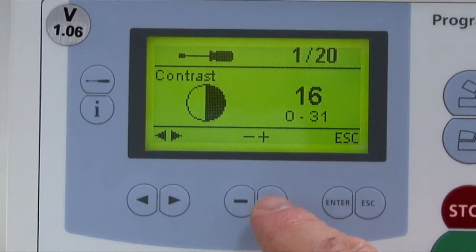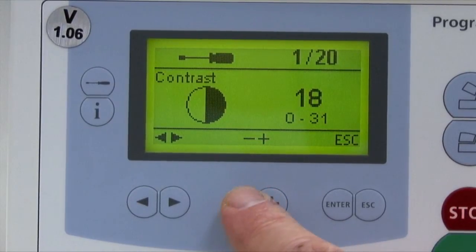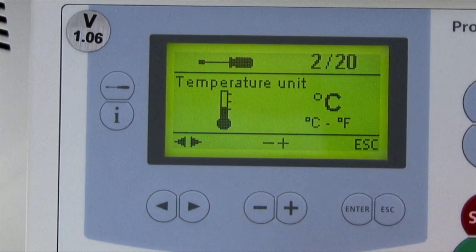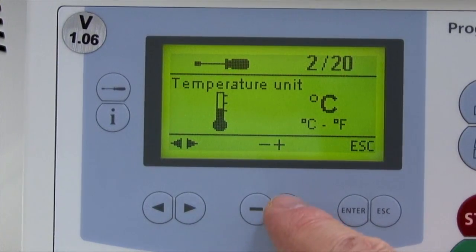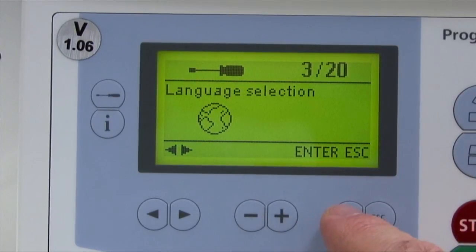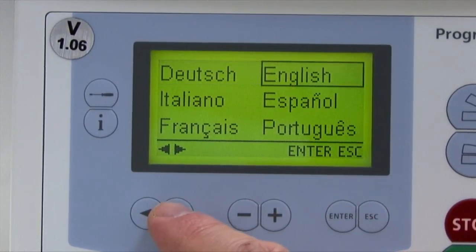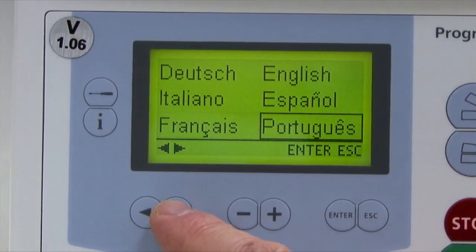The first setting is the screen contrast, which can be set by means of the plus or minus keys. The next setting is the temperature mode; the plus and minus keys are used to switch from Centigrade to Fahrenheit. Next is language selection: select Enter, then cursor to the desired language, then select Enter and Escape.